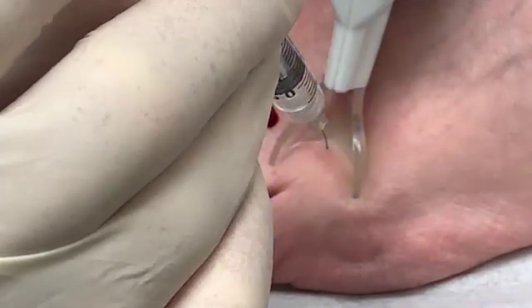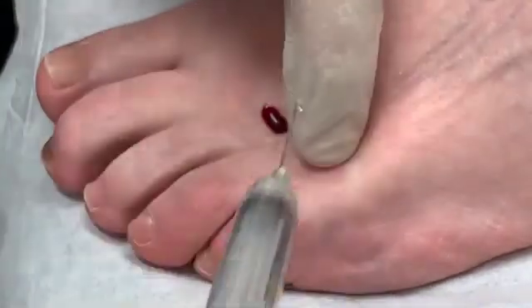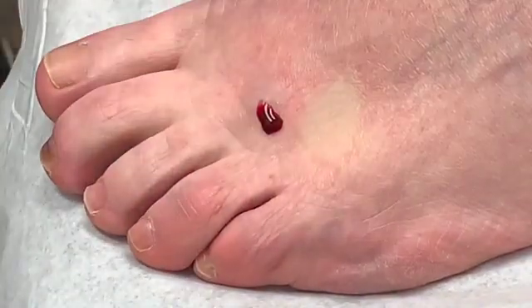She's a very good patient, by the way, because she's taking it really well. It bleeds a little bit sometimes, but that's normal and natural.